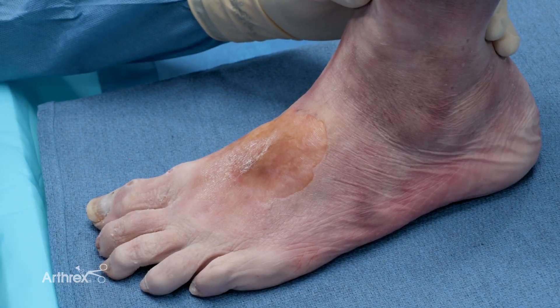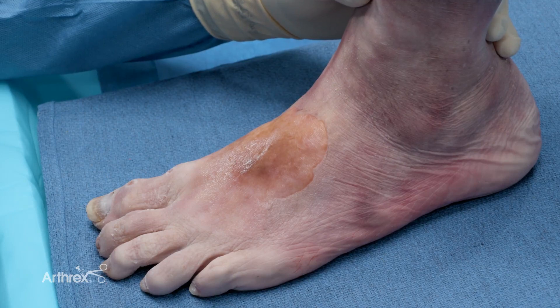Hi, I'm Chris Krulian from Sacramento, California, and today I'll be discussing the Lisfranc fixation with internal brace repair.